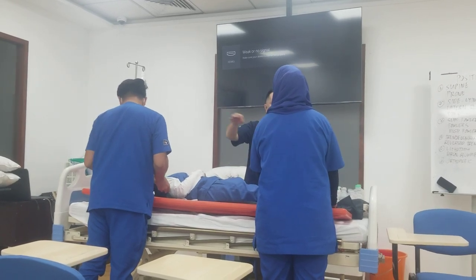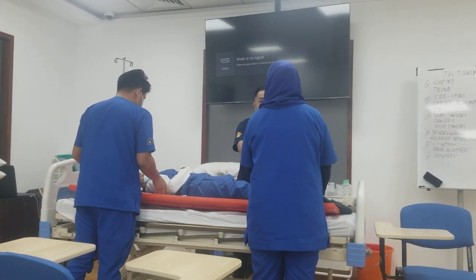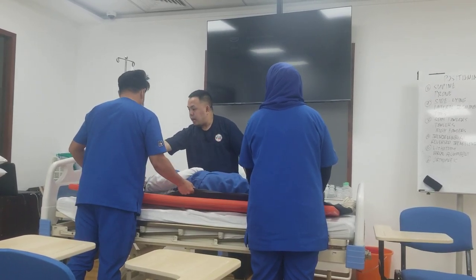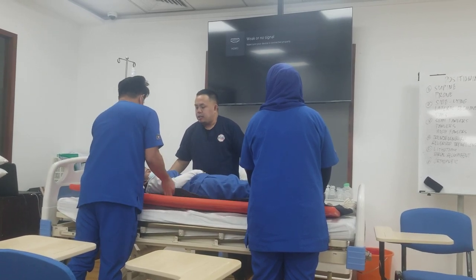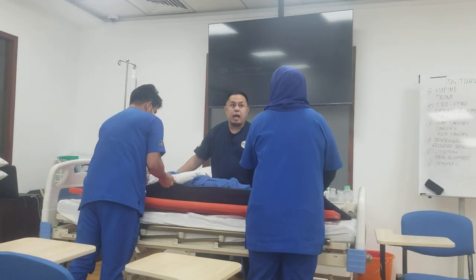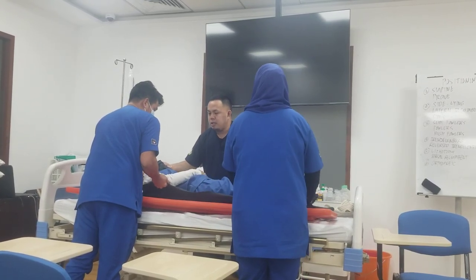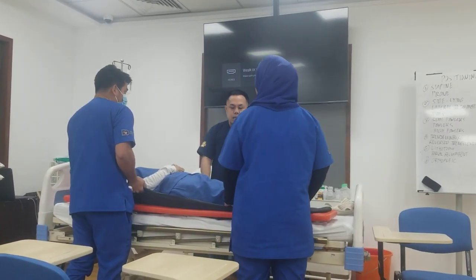With your team, all hold the sheet together — one hand also holding the patient. At the count of three, slide — do not let go. One, two, three. She is now on the board.